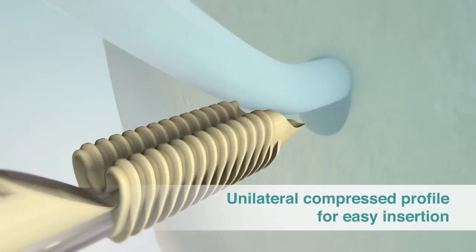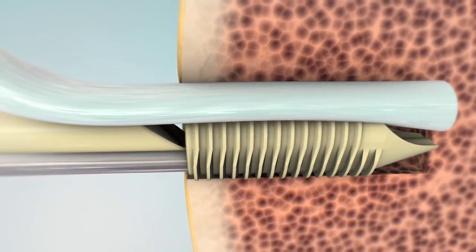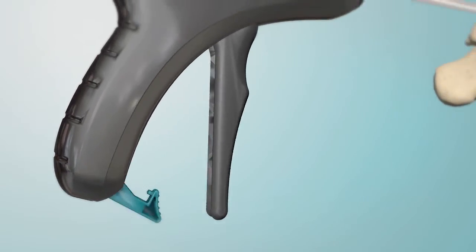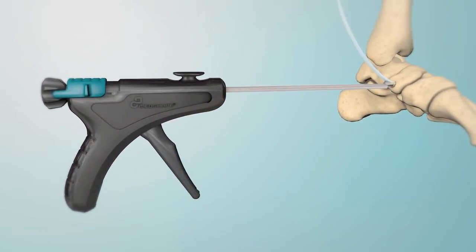The unilateral compressed profile of the sheath facilitates easy insertion alongside the tendon. Unlock and squeeze the trigger for easy, controlled expansion of the sheath and complete circumferential soft tissue compression.